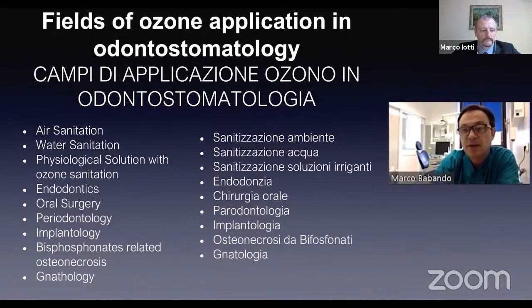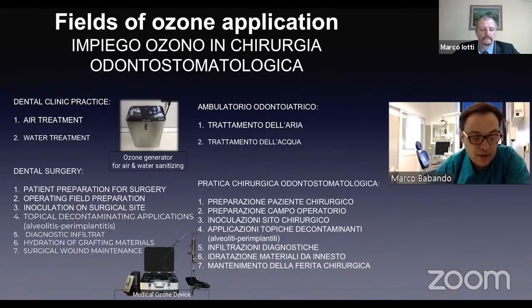antioxidant power. My practice in the hospitals and as a private practitioner allowed me to change my practice after I knew ozone. We use ozone to sanitize the workplace, water, and also all the rinsing fluids, physiological solution, and sterile water. It can also be employed widely, as I said, in the dental practice. We can treat water, air, and also the water used for the patients. And we can treat it with ozone.